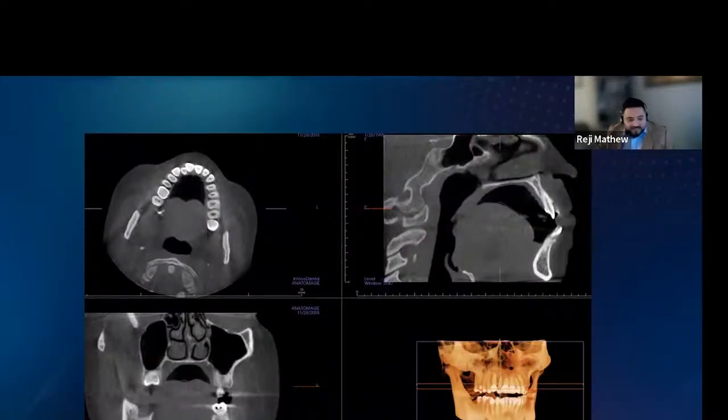Now, before I go into looking at any images, one thing I really wanted to look at is how you evaluate an image. Sometimes if the patient is slightly rotated when you are taking a scan, the first thing is to reorient the data.